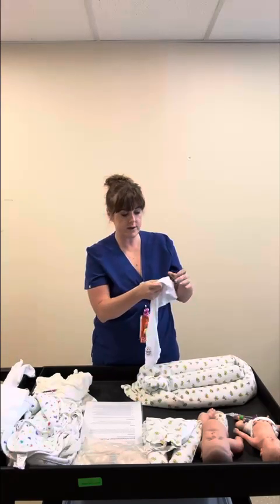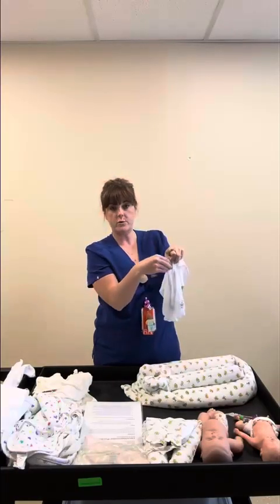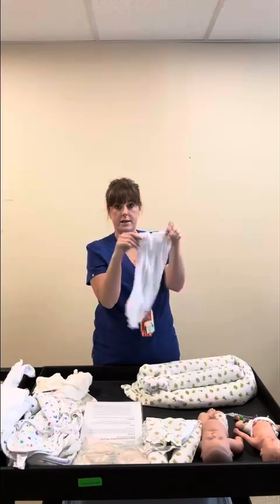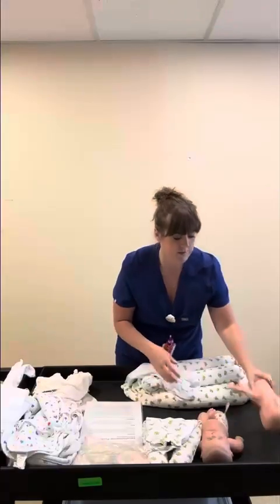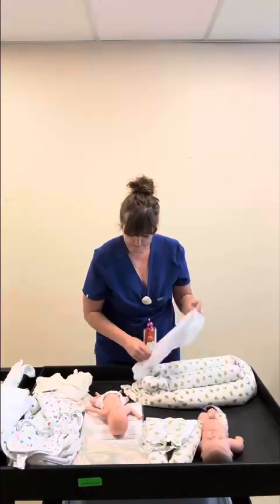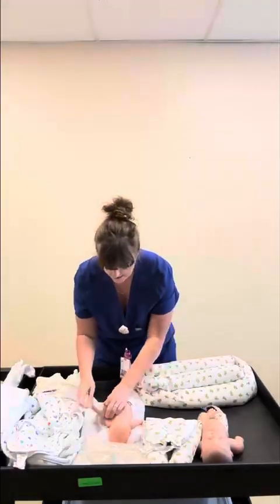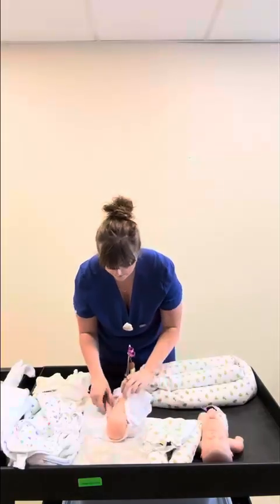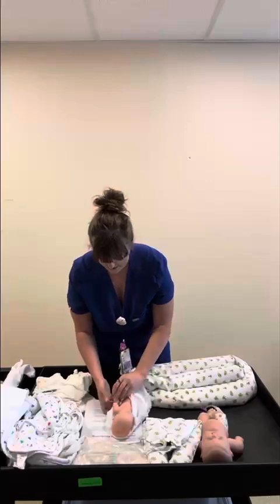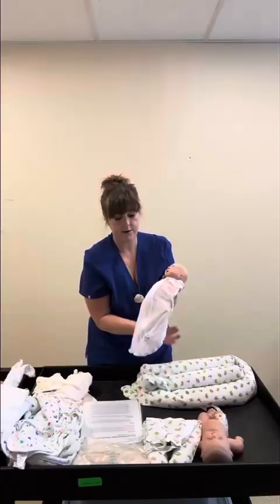This does have a 2-way zipper, which is really handy. That way you can unzip it from the bottom portion and still visualize your umbilical lines and have those free, but have the arms contained. So this is going to be our little 23-weeker. He's a little large and a little floppy, but you can just place him in the Wombi pod. He's not the correct size for any of these products, so you're going to have to do your best to appropriately size. But this allows them to have some containment while they're getting phototherapy.